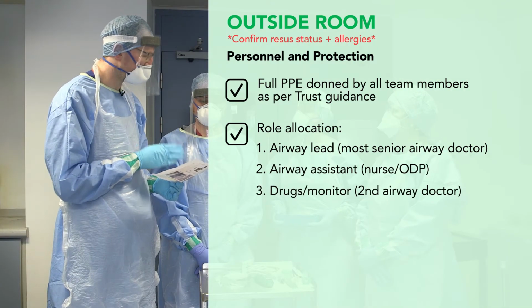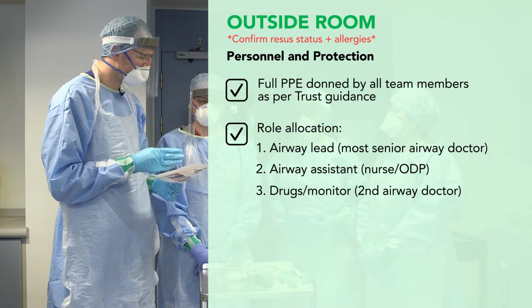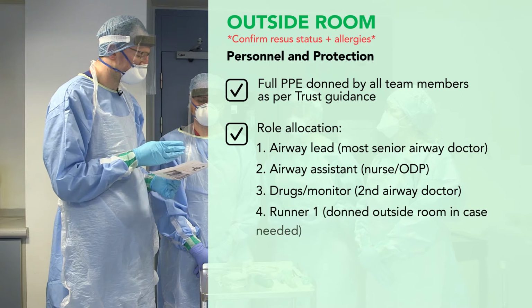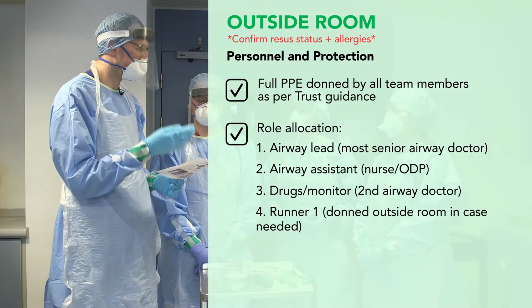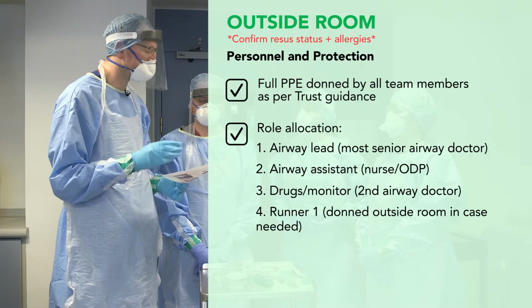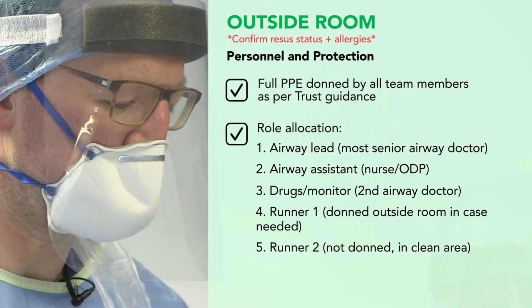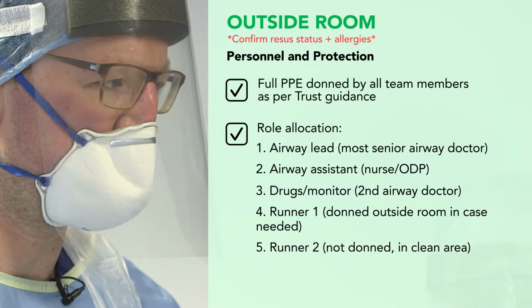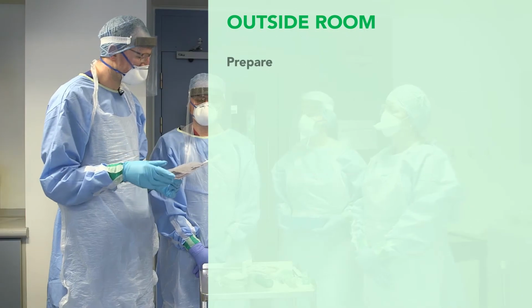Tori, if you could be the second airway doctor and be in charge of drugs and monitoring. And Laura, could you be the first runner? So donned in full PPE but outside the room, and you're in charge of accessing further kit if we require it, in particular front of neck access. And there's also a second runner who's not donned and is in the clean area who you can communicate with if need be. So we're going to move on to the preparation.